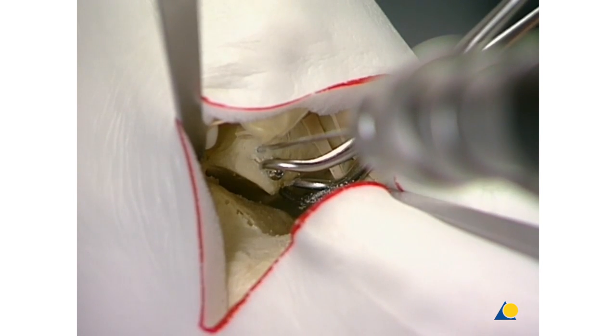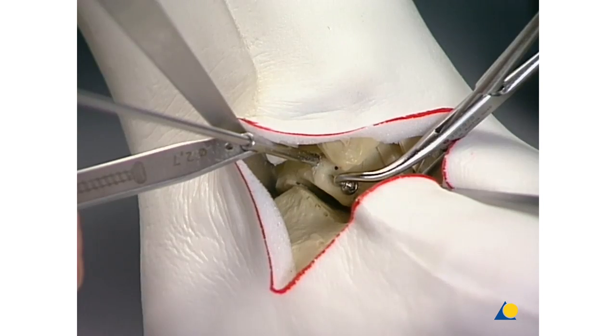Removal of the temporary K wire and lag screw fixation in the frontal plane.